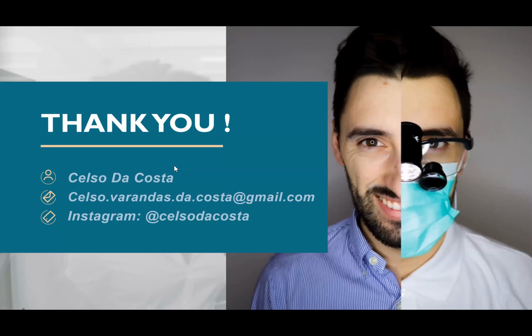That's why I want to follow the rules like you saw in the video at the beginning, the European rules, saying up to 16% is good. And I want to keep our treatment as less invasive as possible. I'm getting good results with the Click and the Touch and home bleaching. So yeah, I'm not using Ultra.